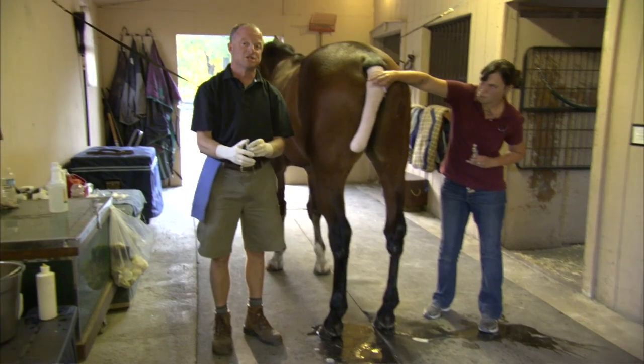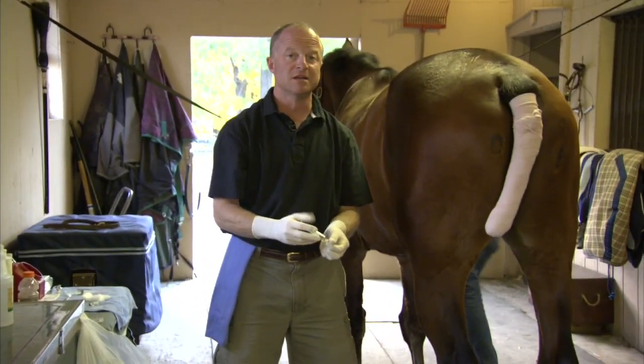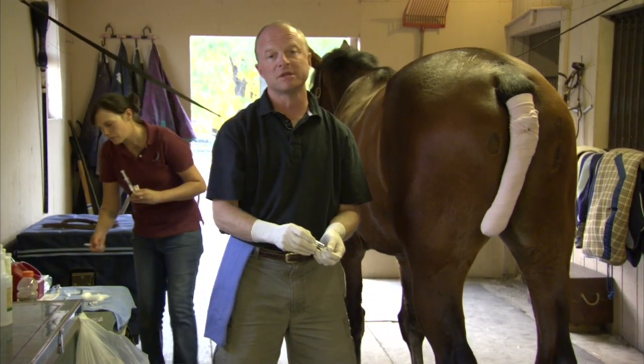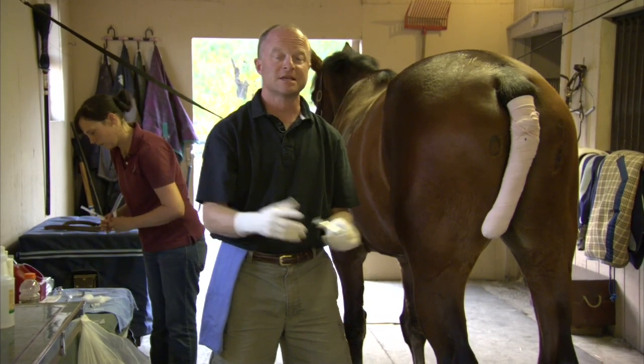Once we've finished injecting all of the joints, the joints will get cold hosed for about 10 to 15 minutes and the horse will be taken care of over the next several days with hand walking and then slowly brought back into work. And that's how we inject joints.